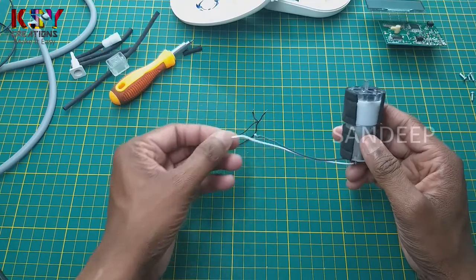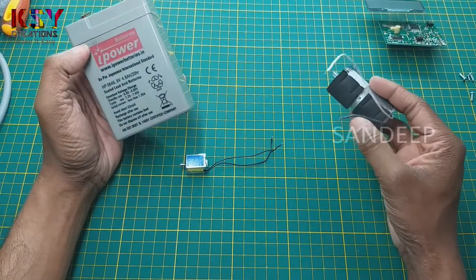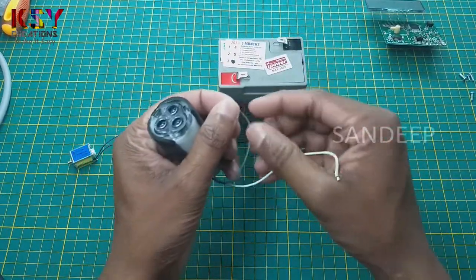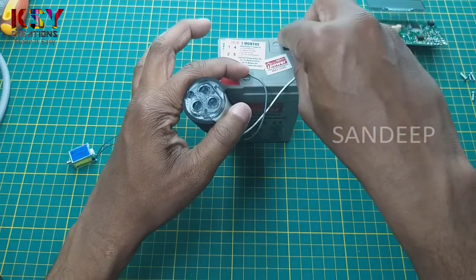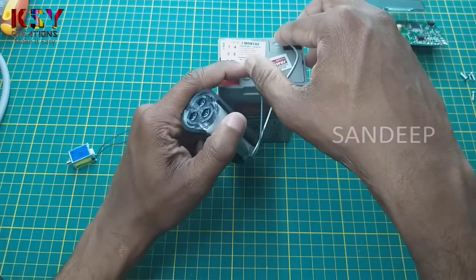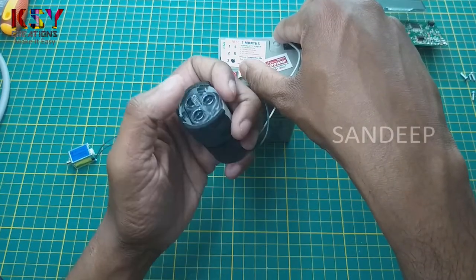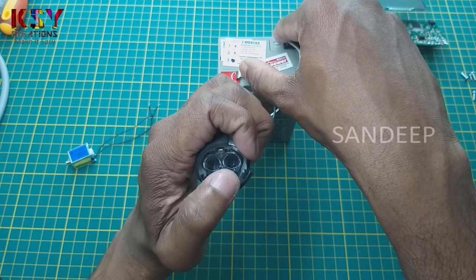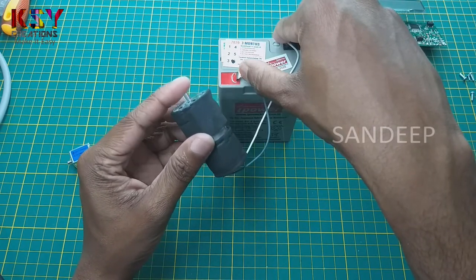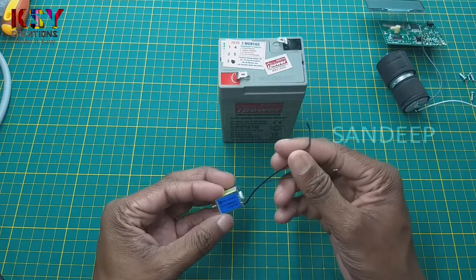I will connect it to the battery and we'll see what this is. We will connect this motor to the battery and see how it works. I am using a six volt battery to check this motor, and there is good sufficient pressure on the output.